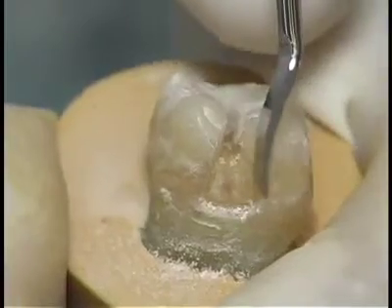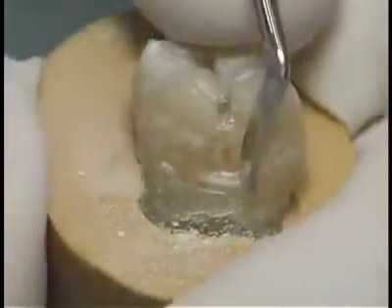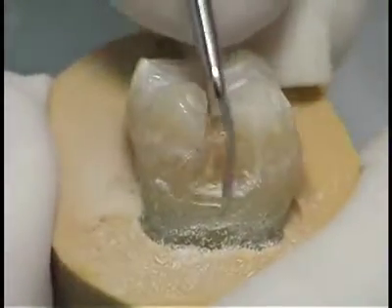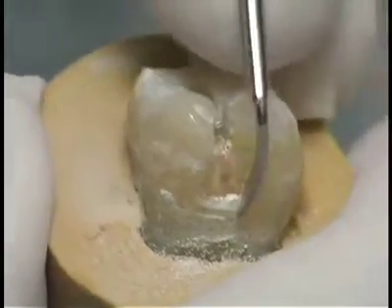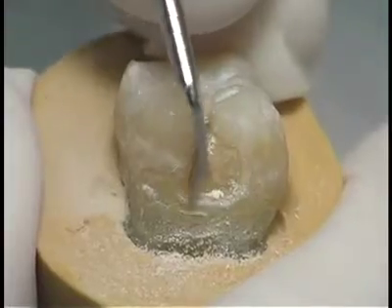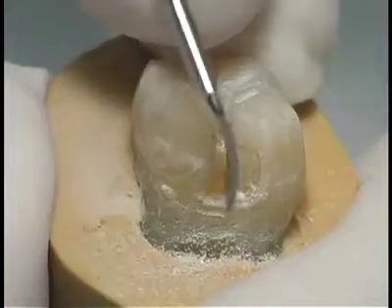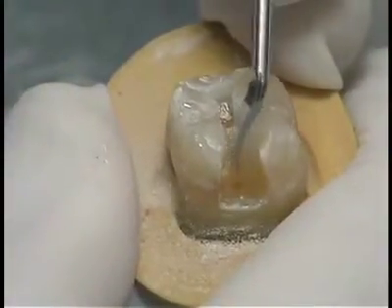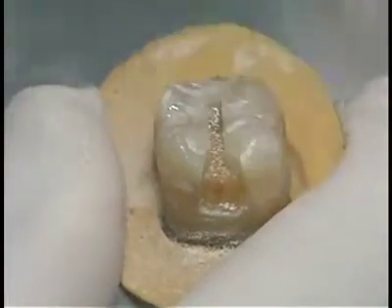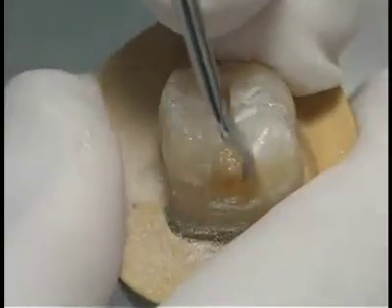Use a gingival margin trimmer for planing the gingival cavo-surface margin. By planing, we develop a small bevel and all unsupported enamel is removed. The gingival margin trimmer is also used to round the pulpal axial line angle. Rounding the pulpal axial line angle decreases the stress on the tooth structure and the amalgam restoration.